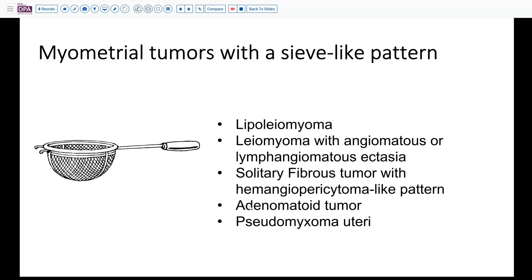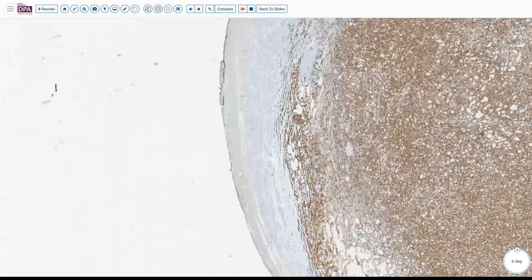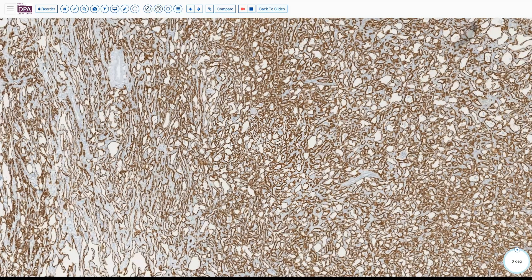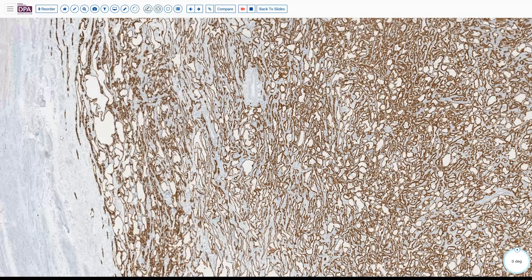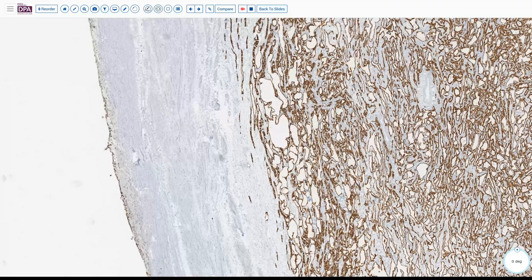Other considerations include adenomatoid tumor and the situation where you have a mucinous neoplasm producing pseudomyxoma uteri. As you may have surmised, this represents an adenomatoid tumor, which is nicely verified here with immunohistochemical staining showing positive cytokeratin on all of these lined spaces, indicating that these cells express cytokeratin, very similar to what's on the uterine serosa.